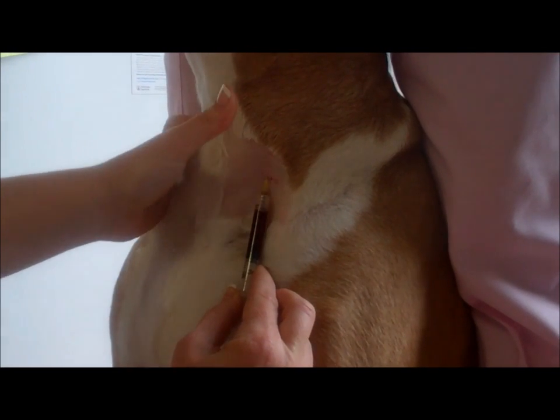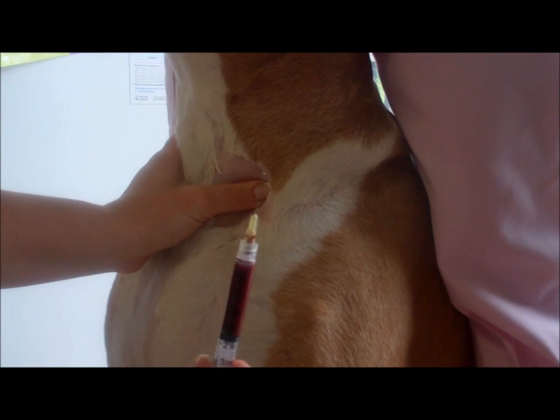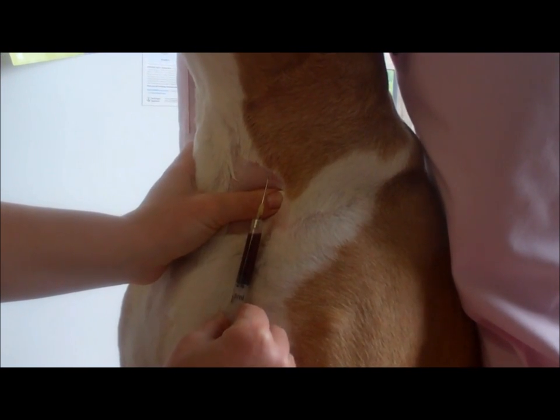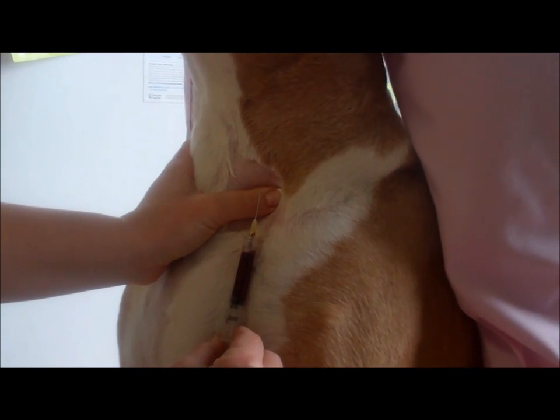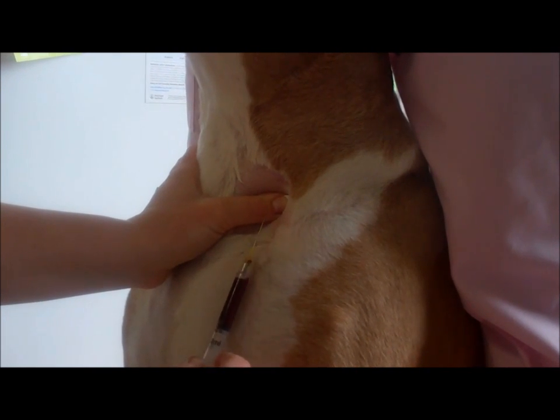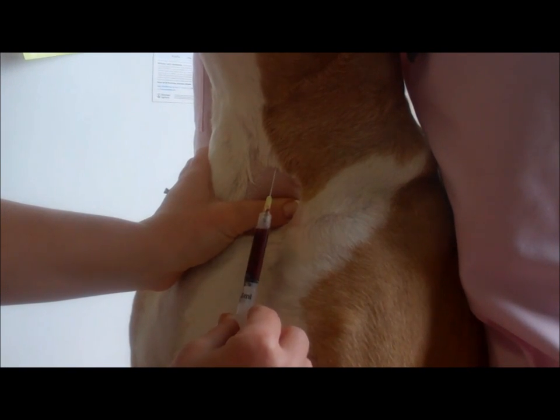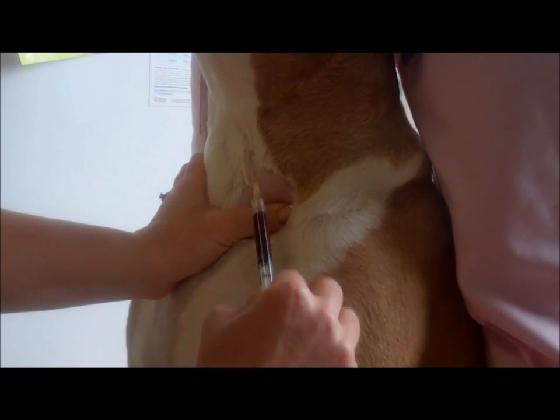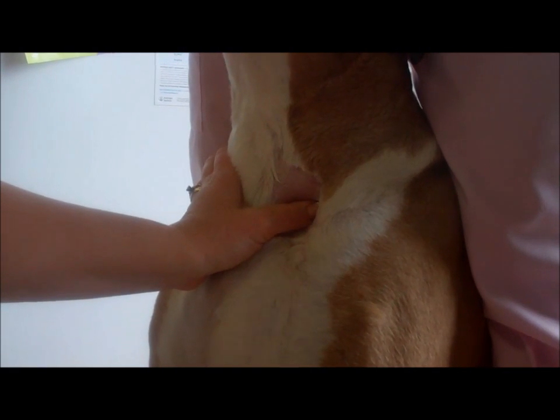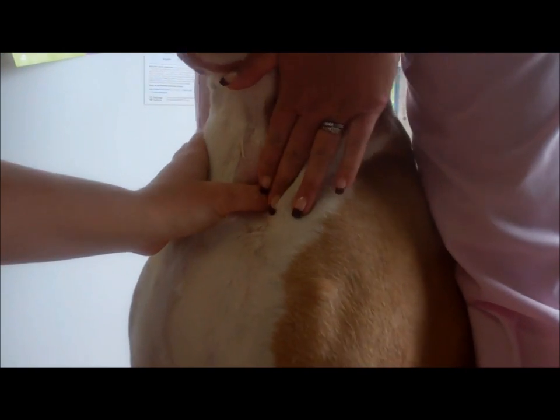I've released pressure and I'm holding pressure now. What you should not be doing is redirecting the needle. If you need to move slowly out because maybe you went through and it's very superficial, that is fine. But you should never be redirecting without drawing the needle out of the body and trying again. You don't want to dig around in the neck — you're obviously going to end up hitting something. Once you've mastered the technique, you won't need to shave anymore, but that's how you do a canine jugular blood draw.